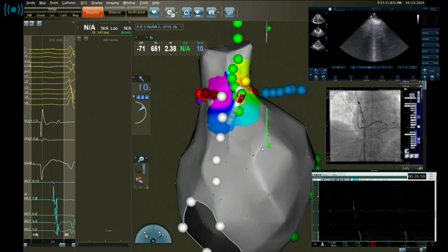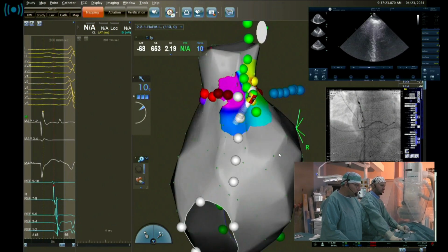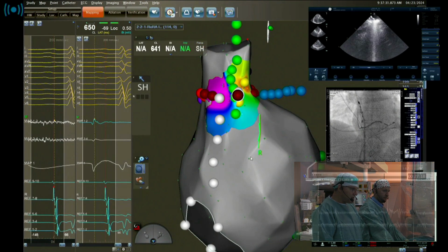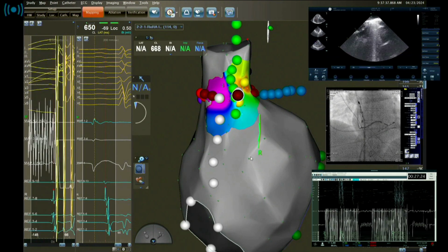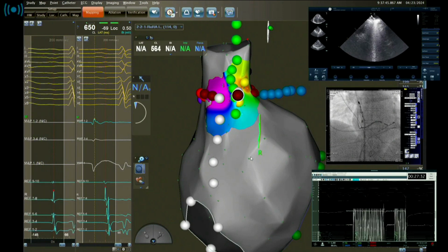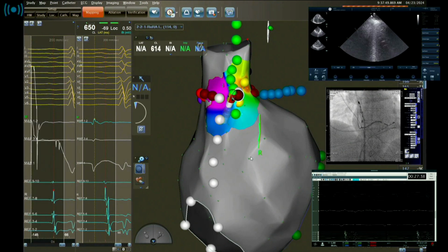All right, so if I may continue, now I am ready for direct hit of phrenic because we are exactly against it. So take a point here because there is loss of view of the catheter during the Centauri system delivery. Now we are applying energy for a couple of seconds. So we take a CARTO tag prior to delivery because we are out of control for a couple of seconds. Now I am waiting for when the catheter will come back to the 3D map.